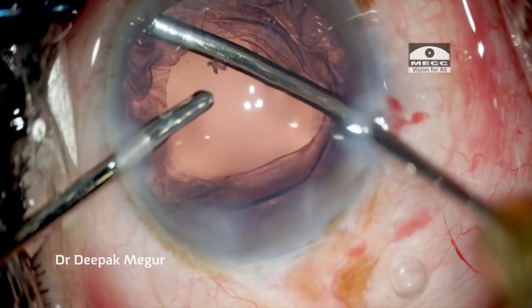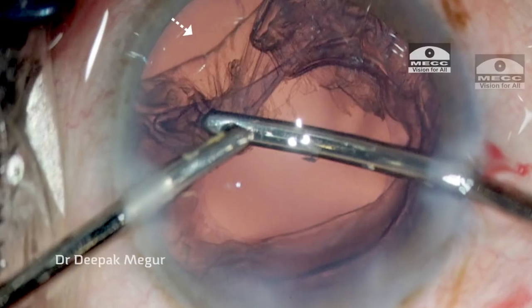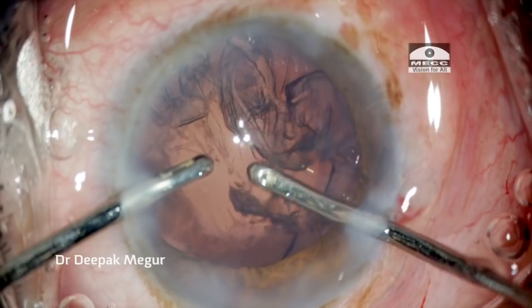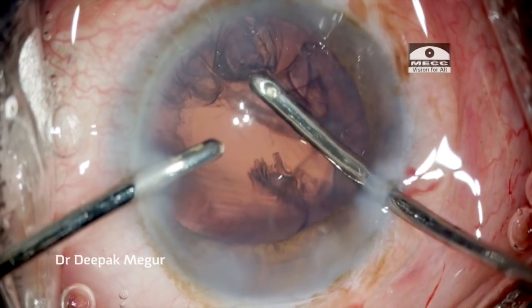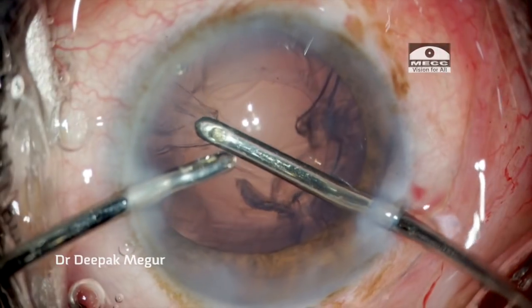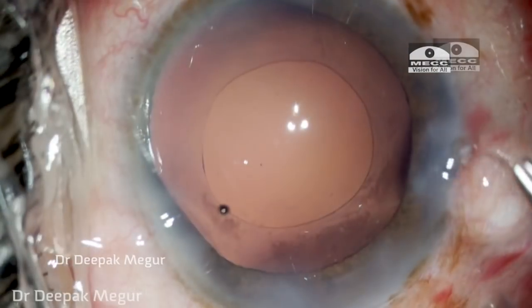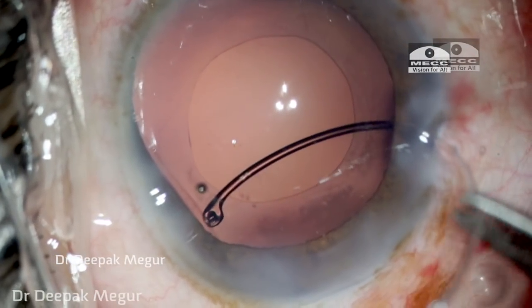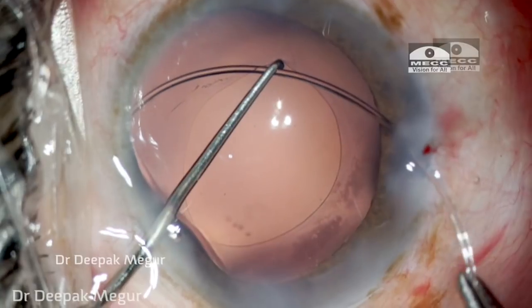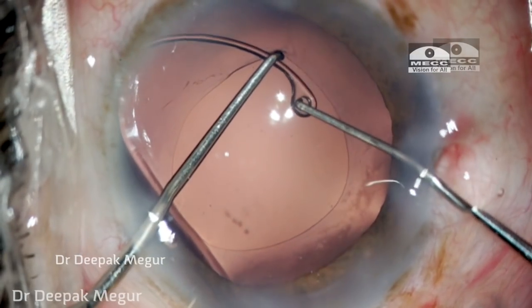Now moving on to the next case — again a case of iatrogenic zonular dehiscence. This has happened during cortex aspiration, more commonly seen in patients with weak zonules. Once we have noticed that the zonular dehiscence is there, I stop, remove the cortex, and then again I am introducing the capsule tension ring into the bag. The bag needs to be very well distended by using OVD, and my Sinskey hook is compressing the ring so that without any stress on the bag the CTR is gently threaded into it.